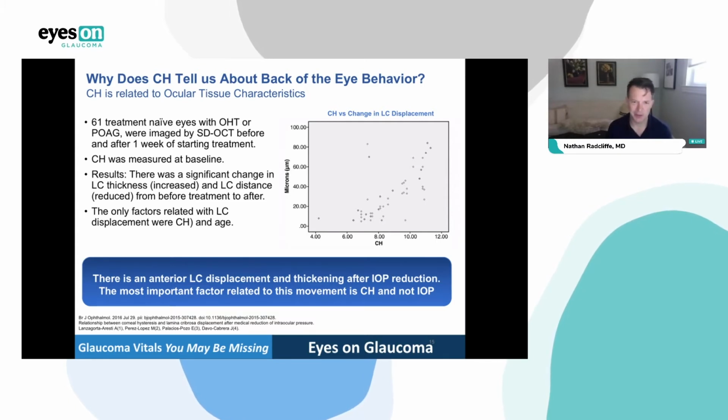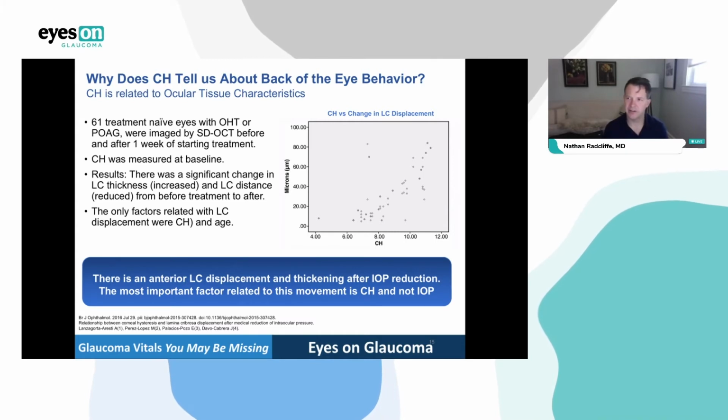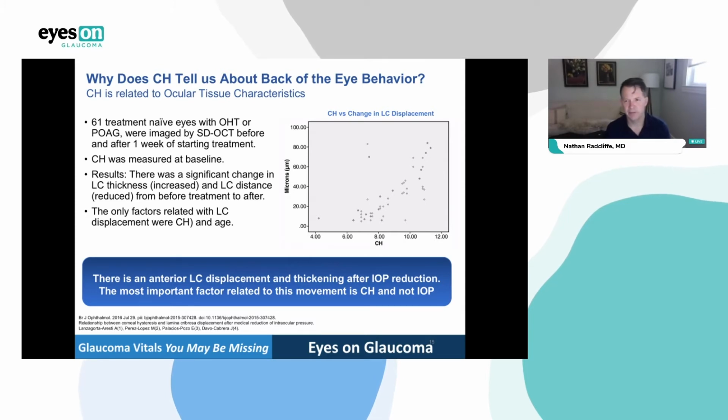And we don't have this paper in the deck either, but I had a study where we showed that you could see optic nerve cupping in serial fundus photos more easily in eyes with a low hysteresis. And I'm thinking, I can't believe hysteresis measured with the Reichert machine is predicting what my fundus photos are going to tell someone who knows nothing else about the patient, who is just looking at fundus photos. And what you end up seeing is that in eyes with a lower hysteresis, you're going to see more change.